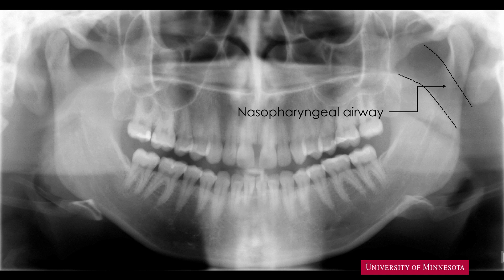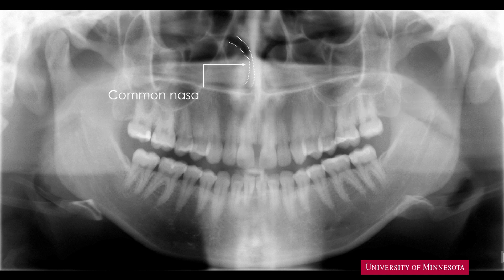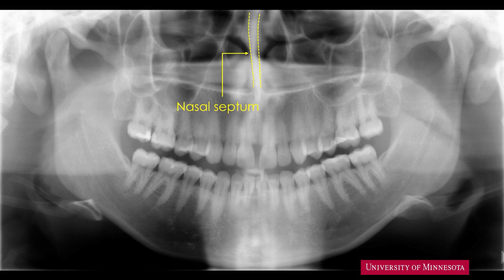Near the midline of the maxilla, there is a curved radiolucent band — the common nasal meatus. I am tracing the right meatus; please try to identify the meatus on the left side. Now that we know the common nasal meatus, we can identify its medial border — a thick radiopaque band at the midline of the maxilla — the nasal septum. The other border of the meatus is a curved line of contrast; these curved structures are the anterior parts of the inferior turbinates.